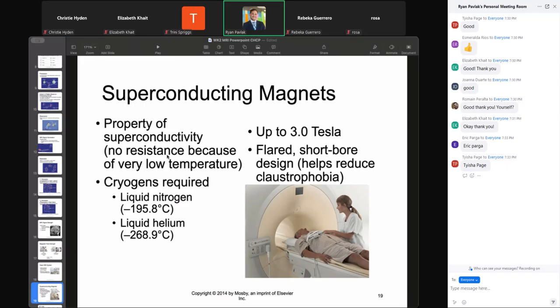If you turn a superconductive magnet off, you're looking at right around $50,000 to $70,000 to get it ramped back up. So when an MRI unit is turned off, the superconductive magnet is not. Even if you've ever seen an MRI trailer rolling down the road, they've got a huge magnet in that trailer. It's going to be shielded. People are going to be okay driving next to it. However, that MRI unit is always on. Even if the computer's not powered on, the magnetic portion of it is.